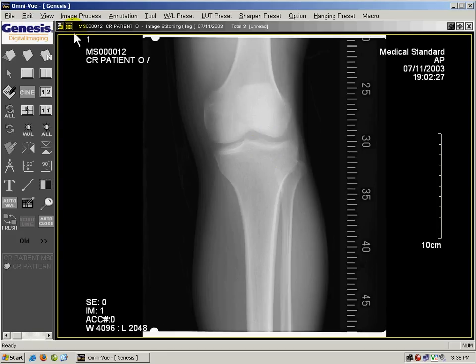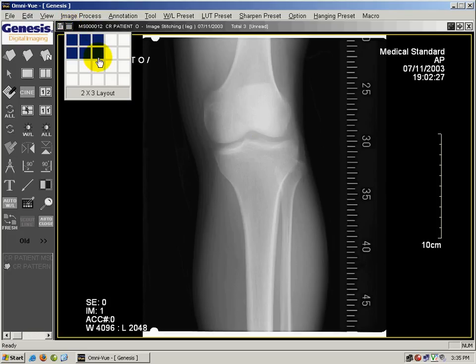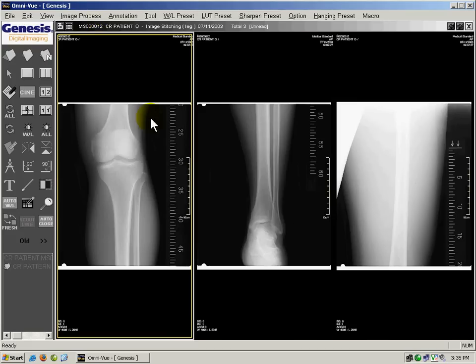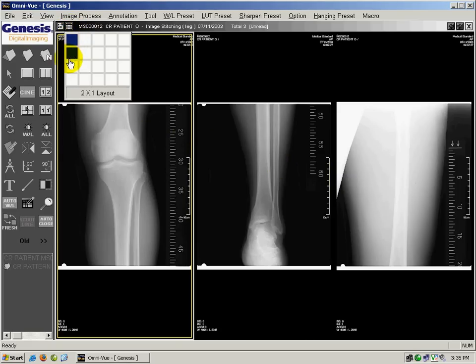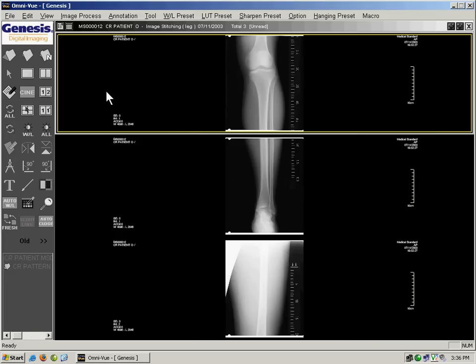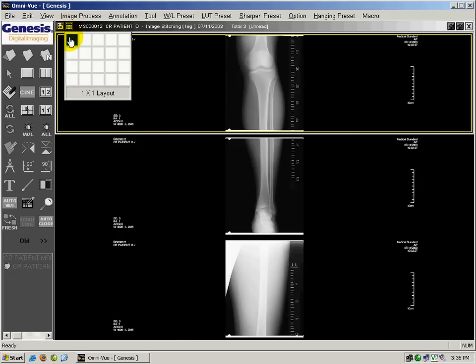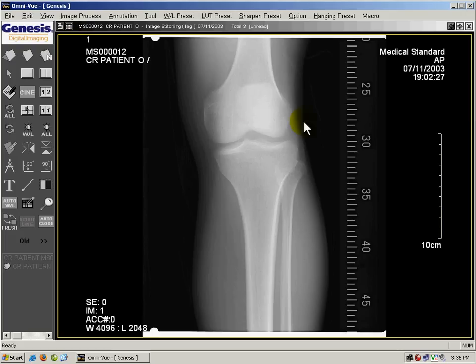You can also display multiple images on the same screen by clicking on this button here and dragging out the layout that you'd like to display the images. Since there are three images, I'm going to display it one by three and it's going to display the images side by side. You can also hang them on top of each other — so I'm going to do a three by one layout. I'm going to go back to viewing one by one by clicking one by one layout to go back to the original view.